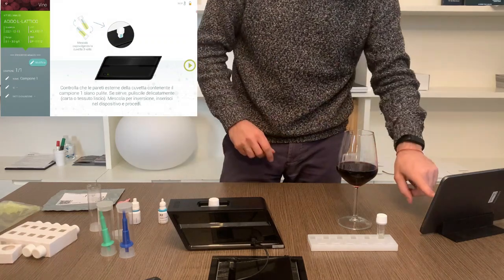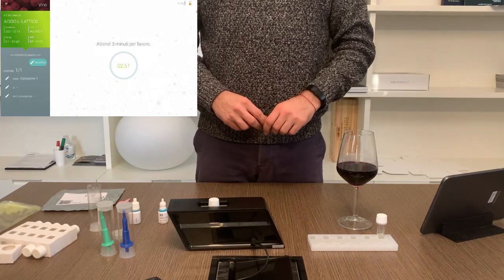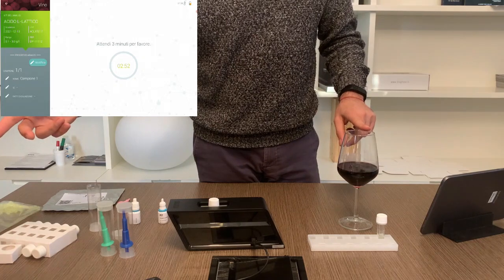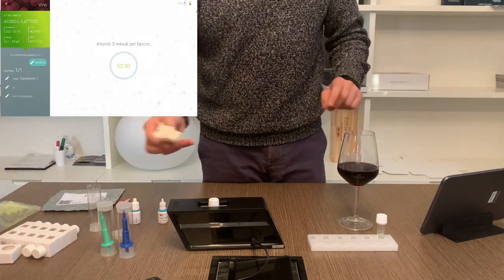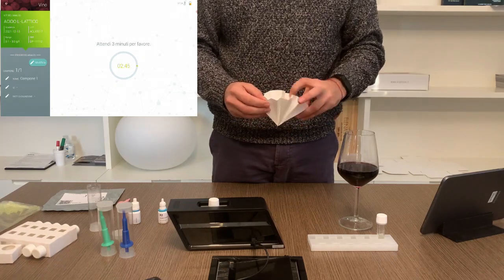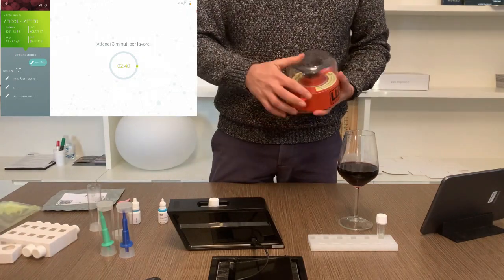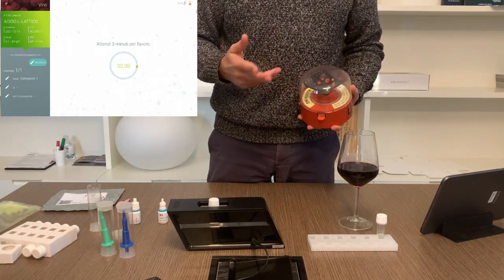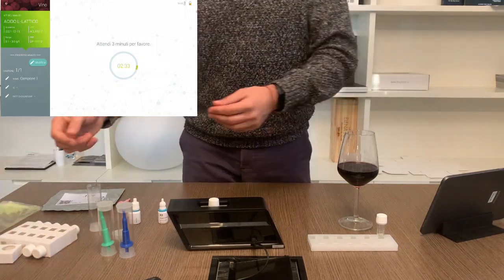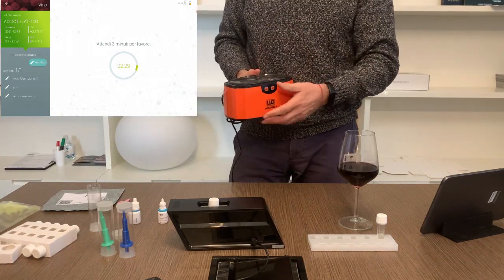All waiting times are managed by the app so you only have to wait for the timer to end. We said that the sample must be filtered, so if necessary you can use paper cone filters or a centrifuge which speeds up the filtering operation. When it is necessary to degass the sample, you can use an ultrasonic degasser which, thanks to its vibrations, speeds up the process of CO2 release.